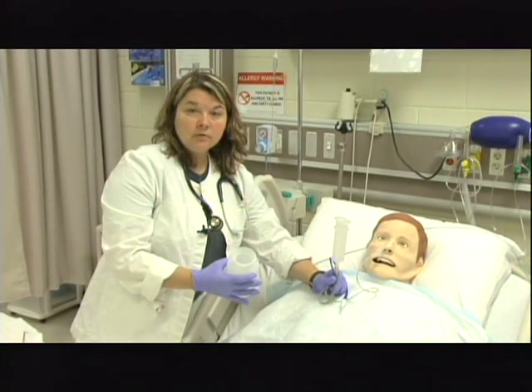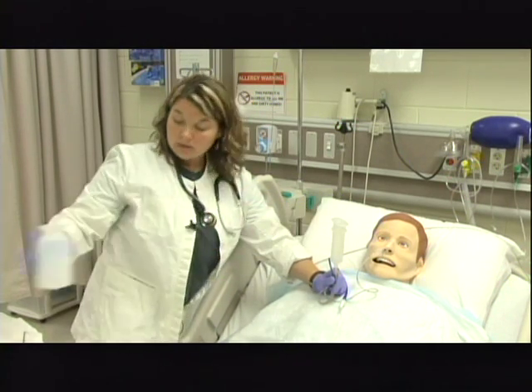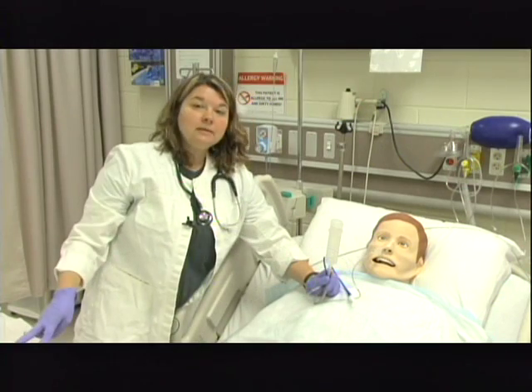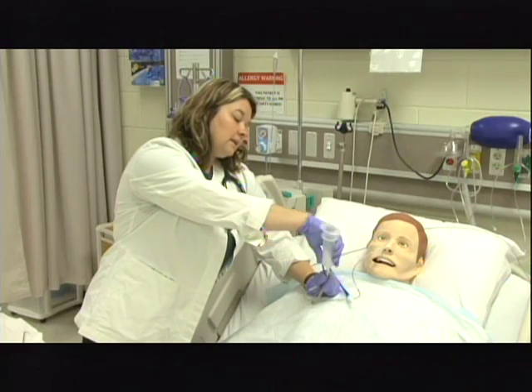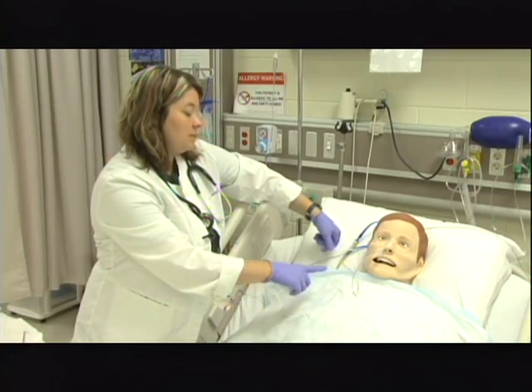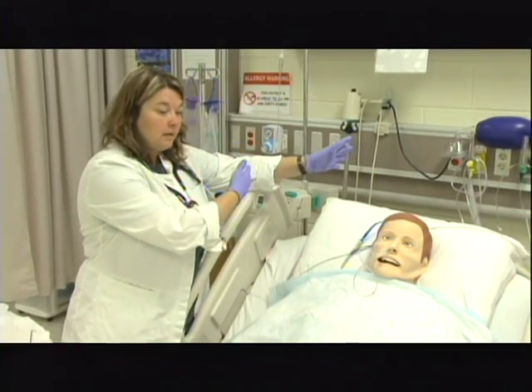At the end, depending on your hospital policy, you may flush with 10 milliliters or more. So I'm going to go ahead and flush with about 30 milliliters to make sure that I'm clearing the entire tube. I'm going to hold it up and clamp it off. I am now completed, because I only had two to give at this point, and I have flushed. So I'm going to take this off. I'm going to put the anti-reflux valve back in, and I'm going to put it back above the level of the patient's stomach. I'm not going to reattach it to suction, because obviously all of it would be suctioned back up into the wall canister.